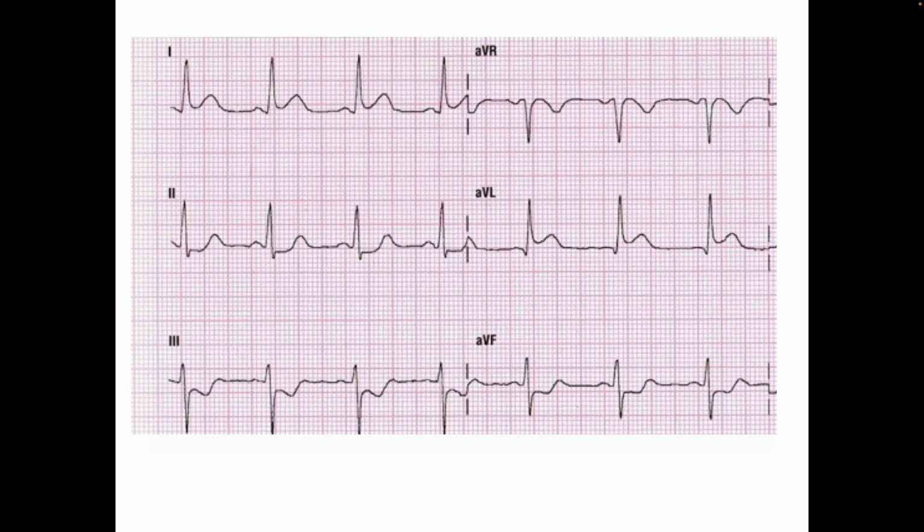So if there's a high lateral STEMI, it's very common to have reciprocal changes in 3 and aVF, maybe in 2, but rarely just in 1. It happens. However, if you have ST elevation in 2, 3, aVF, so you look at 1 and aVL for the depression, it's very common to have depression here but not here. Okay. In which case, it's still good. Okay. Yeah.